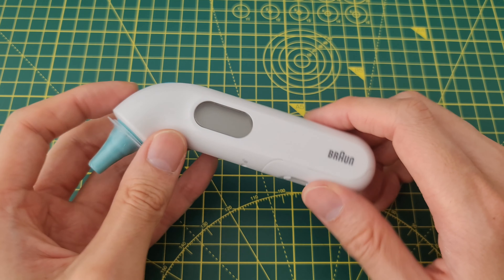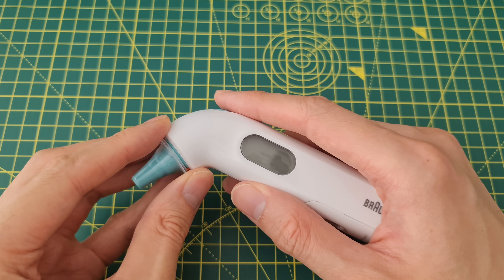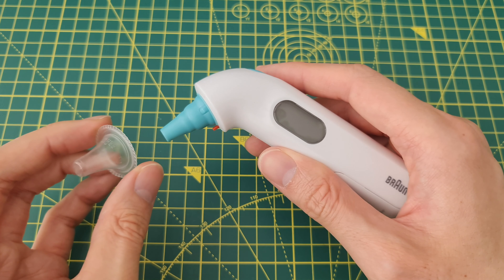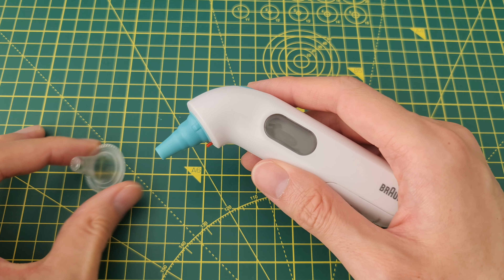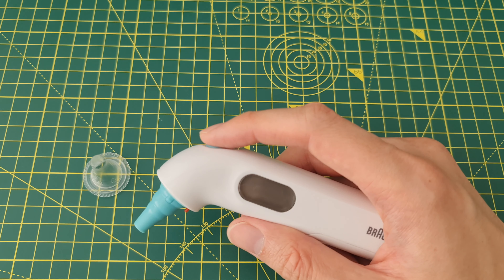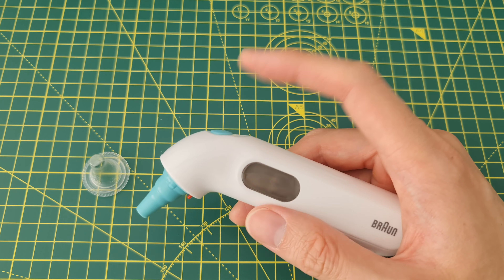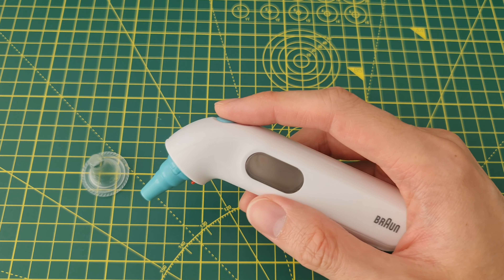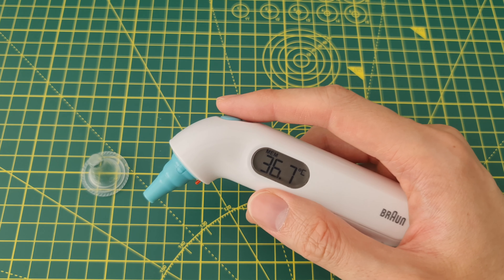There's only one button so it's limited ability that you have. The easiest way to do this is to take off the sanitary cap because it keeps triggering the button. If you don't have the device powered off, you need to power it off by holding the button.